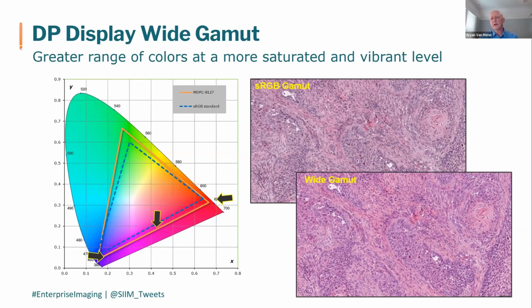This is a two-image representation that builds pretty fast. One is so exaggerated, especially when it's my display and your display in the webinar. This is a very good image. This is what's expected. Pathologists are very impressed with that image. This image here is a wide gamut. It is expansive. It is a little bit overly expressive. It always accentuates. But what does it accentuate? It accentuates the eosin stain, which is the stroma or the connective tissue. So it's not just nuclei or lymphocytes to be looked at with the purple. The stroma has disease in it as well, and this can help some pathologists or aid them in seeing the disease within that area of the individual stain.